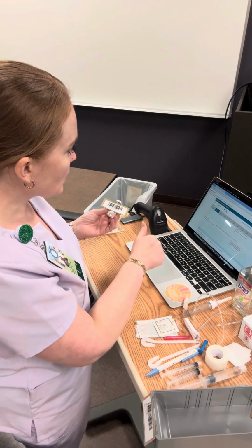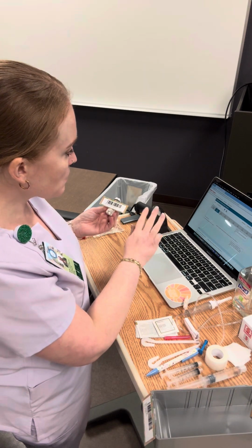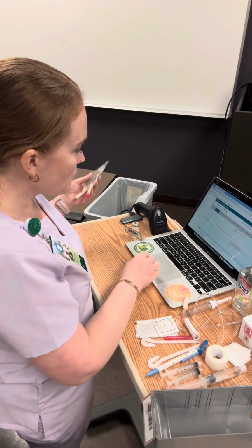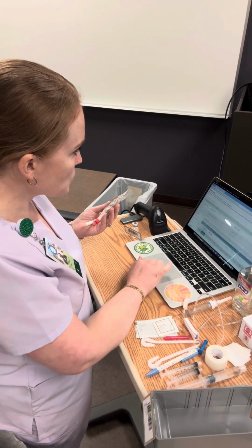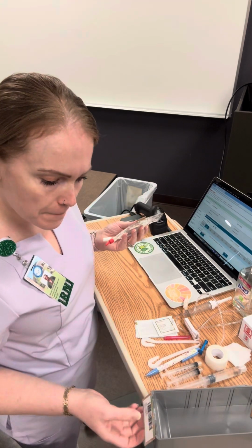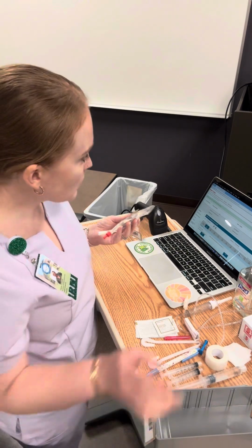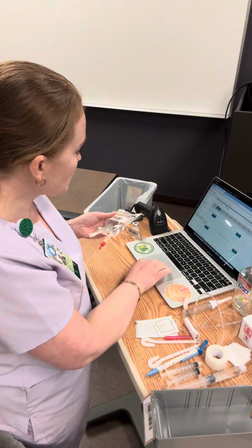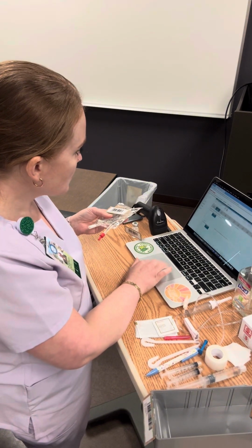And so we have the client, drug, dose, route, and time. So MedCheck 2 is done for that medication. We're going to scroll up and double check. Code Brown 61851. Code Brown 61851. And I'm going to scroll down because now I have meropenem in my hand.